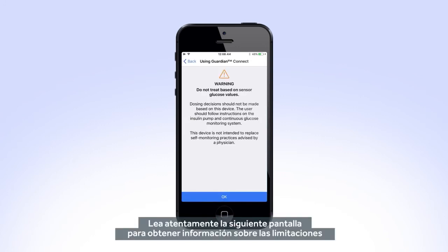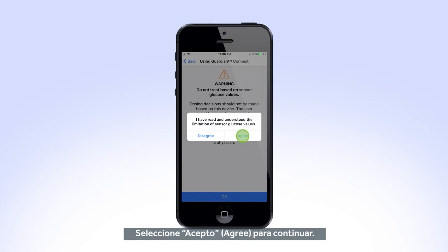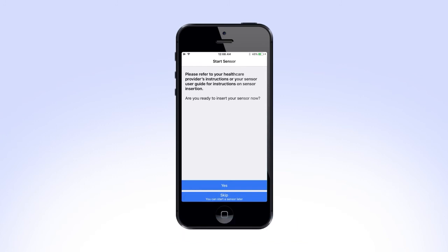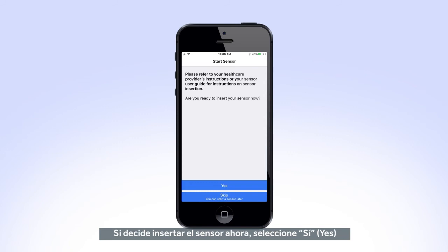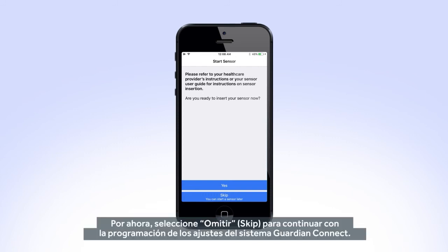Carefully read the next screen for information on the limitations of sensor glucose values and press OK. Select Agree to continue. On the next screen, you will have the option to start a new sensor, or you can skip this section and insert the sensor later. If you choose to insert the sensor now, select Yes and refer to the instructions on the Guardian Sensor 3 insertion video. For now, select Skip to continue programming the Guardian Connect system settings.